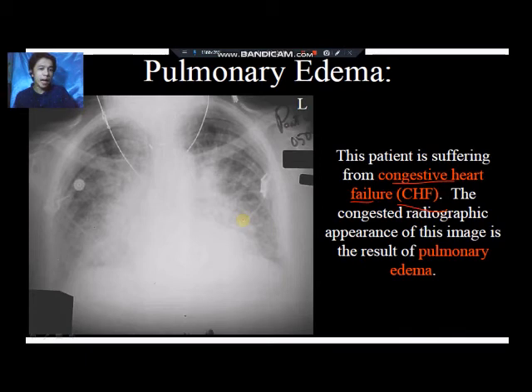So again, no, kung naay CHF si patient, naa siya'y condition sa iyang heart, na nagka-heart failure si patient, possibility na madamay pod sad ang ato ang lung fields. Kaya diba? Silingan ra na sila. So if ever this soft tissue structures or this cavity, if daghan na kay na siya fluid ra, some of the excess fluid can seep out, no, mag-escape na sila from the cavity that surrounds the heart into the cavity that surrounds our lung field. So muna magtapok na rin na sila dito, which will cause pulmonary edema.